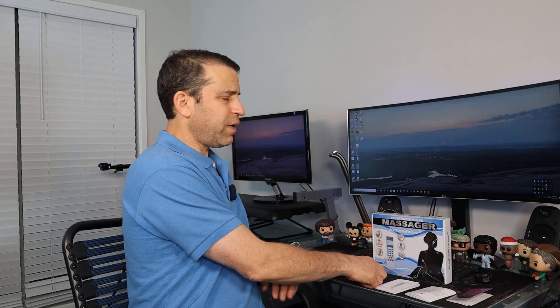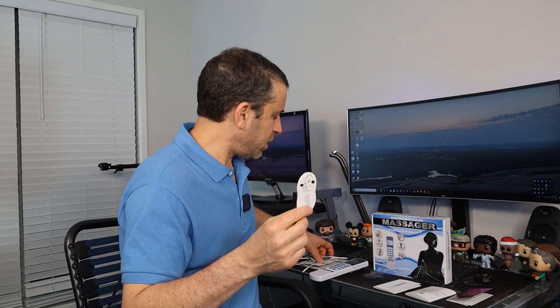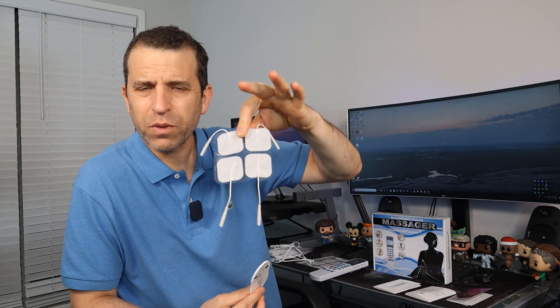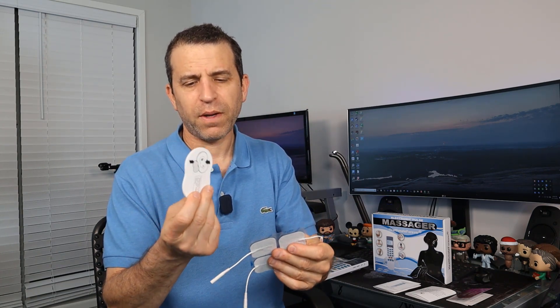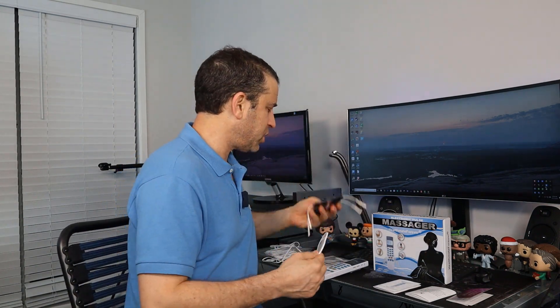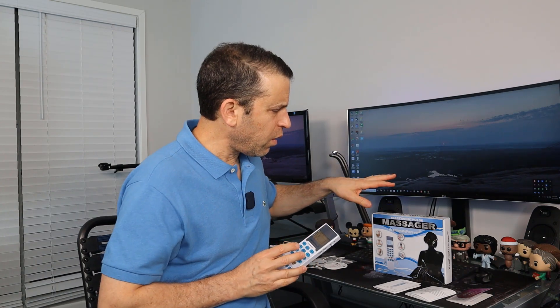You get a plastic piece where you can store the pads that come with it — a total of eight pads. I'll dive more into how you can use all eight pads at once. You can put two on here, one on each side — you can't do two on each side because it won't fit. You also get one plastic sheet for the pads, and then four sets of wires with dual connectors that go to the pads and plug into the device.